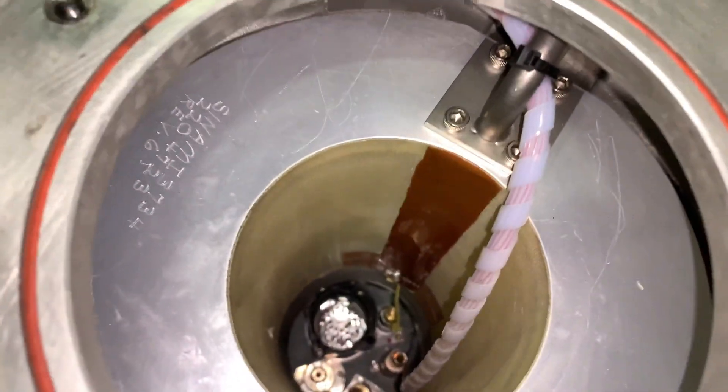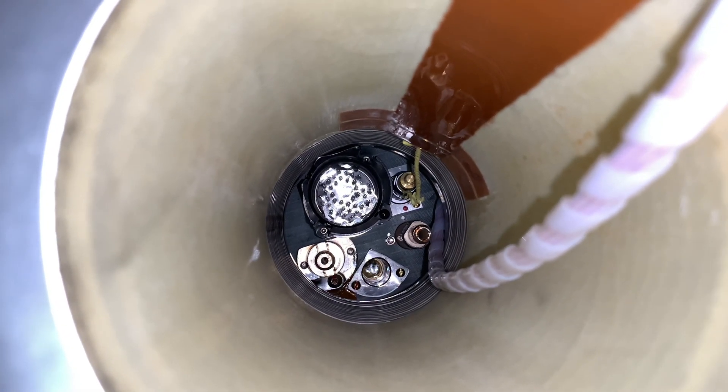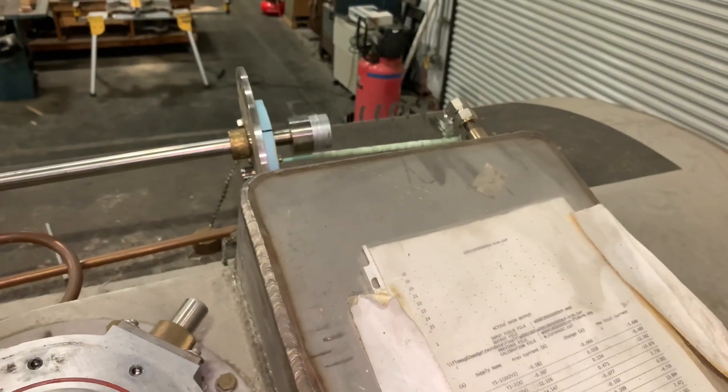The port on top of the magnet contains the ramp and shim connections. This is where high-amperage power supplies connect to the main coil inside the MRI magnet. This allows the field engineers to tune the static magnetic field inside the MRI scanner.